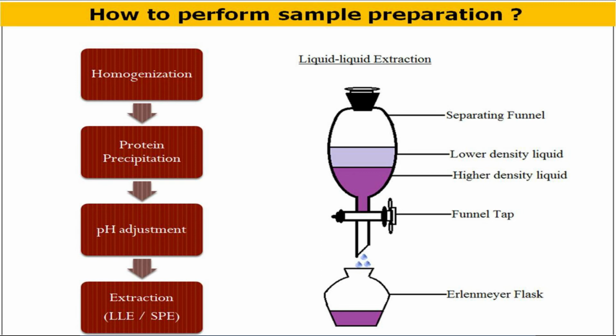Because we are doing extraction in an organic solvent, for example, chloroform or diethyl ether. These organic solvents are not able to dissolve any ionic compound. They are only able to dissolve non-ionic compounds, or compounds which are in their molecular form.